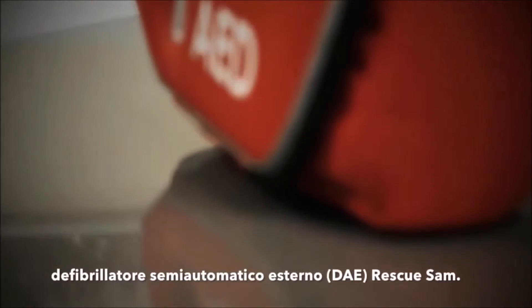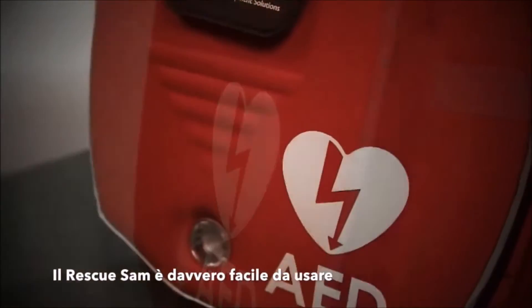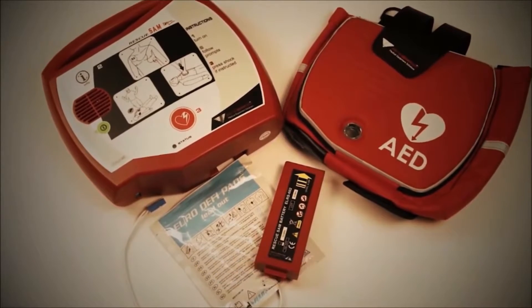Hello and welcome to this short video demonstration on the Rescue Sam Semi-Automatic Defibrillator. The Rescue Sam Defibrillator is really simple to use and comes with a protective bag, long life battery and a set of ready to use adult pads as standard.